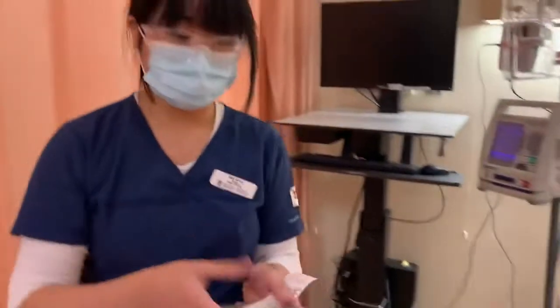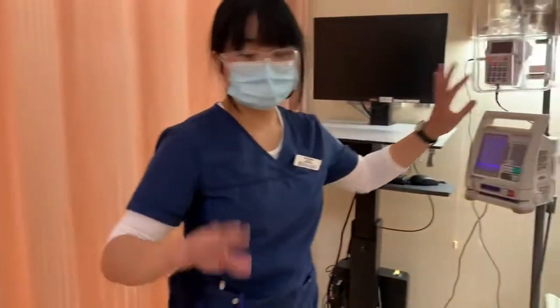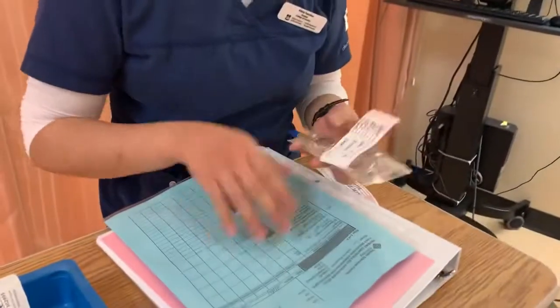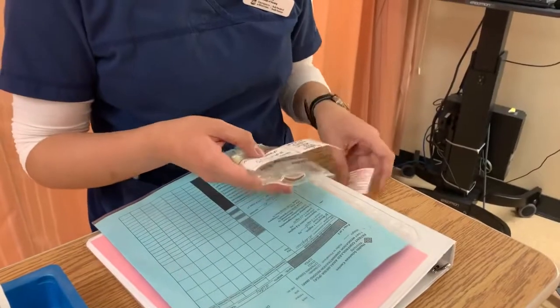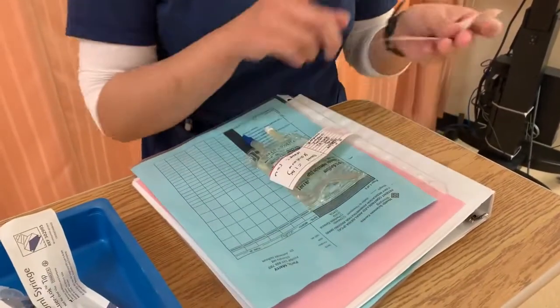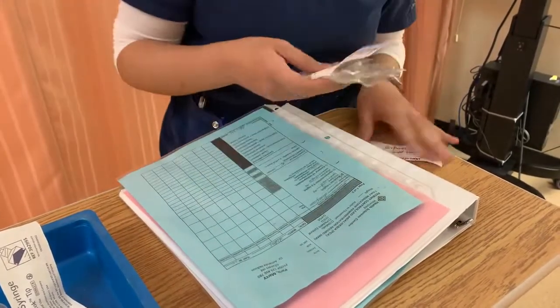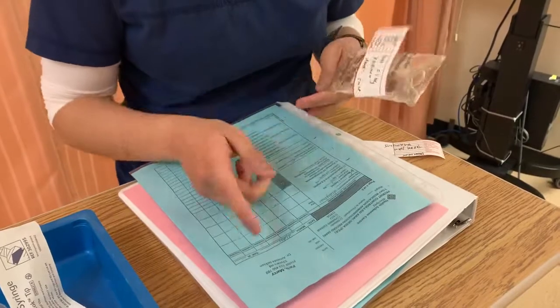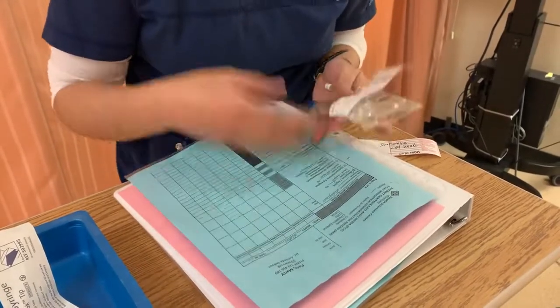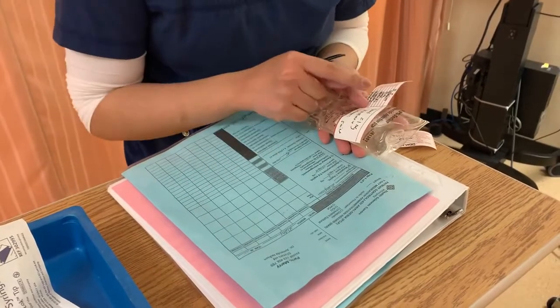And now, I'm just gonna, sorry, how much time? 10 minutes. 10 minutes? Okay. So now, I'm just gonna do my third check. So I checked that it's the right patient. So I got Marcy Paris, MP, and we got our dosage, our label for the tubing as well ready in here. And now, so we checked the right patient. That patient doesn't have any allergies. They consented. Medication is morphine, right medication.